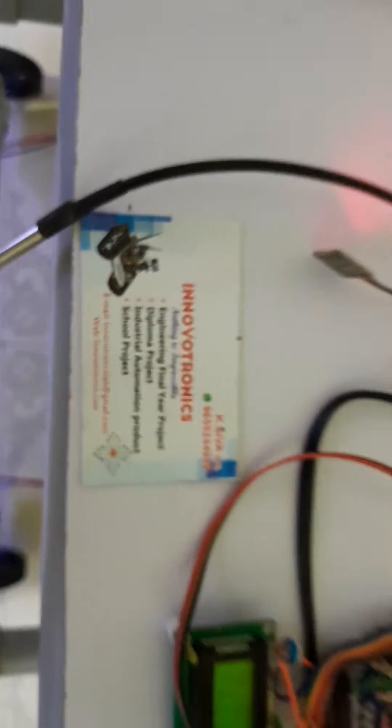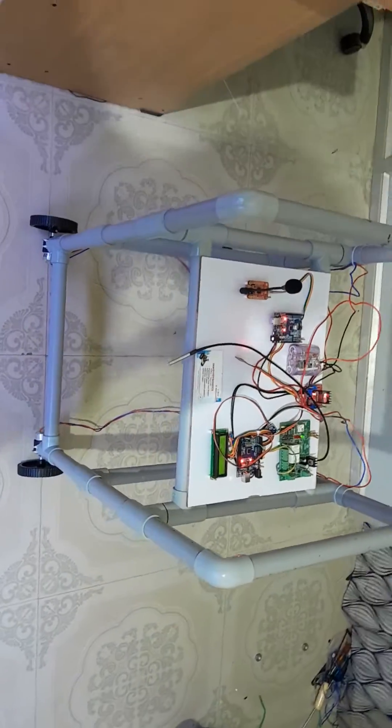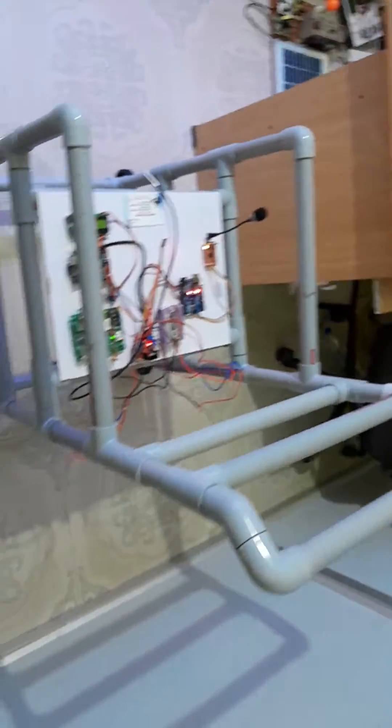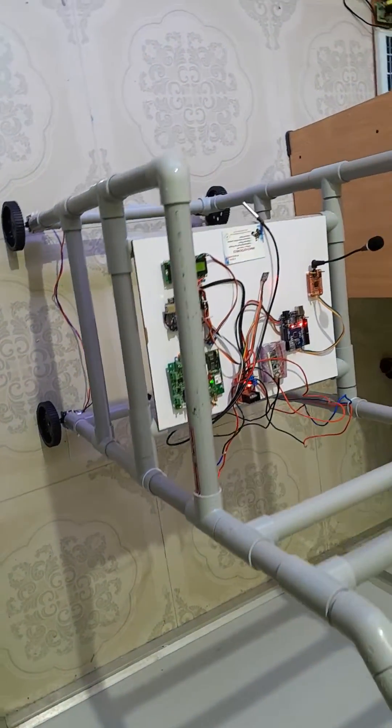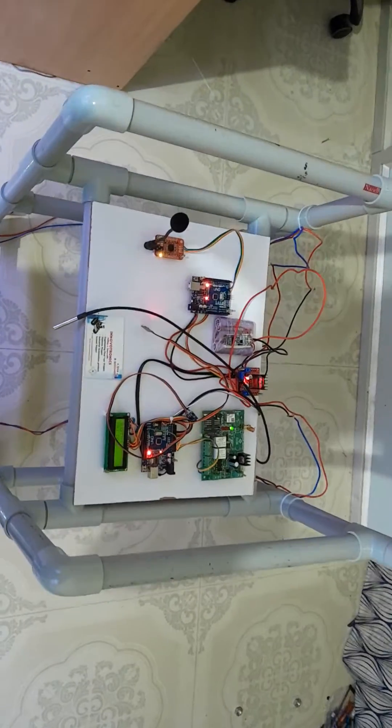Welcome to Innovation Electronics. In this video, I'm going to explain a smart wheelchair project for physically challenged people. This project is designed using PVC pipe — this is the complete setup. This project has a lot of features; physically challenged people can easily check their health status inside the system.